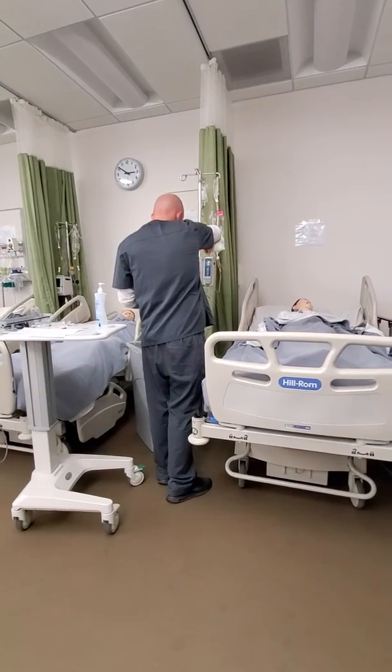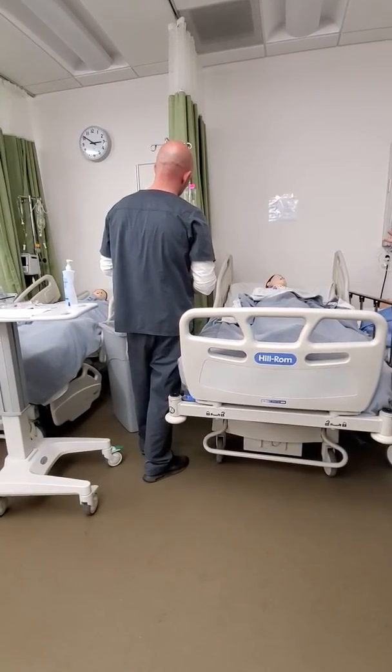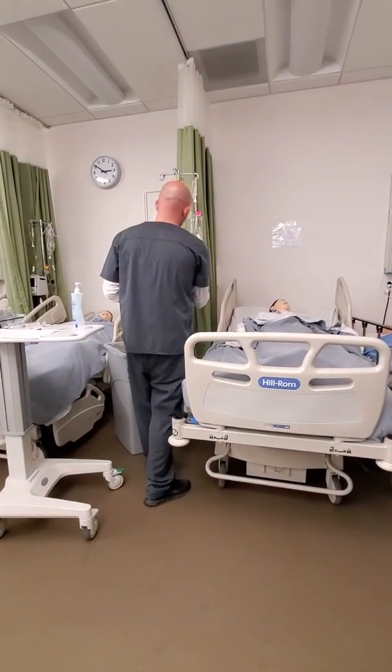So when it's in, the reason we can have you open up all the clamps and it won't run is because when the pump is off, it's clamped in the pump. So I have to open up this clamp.